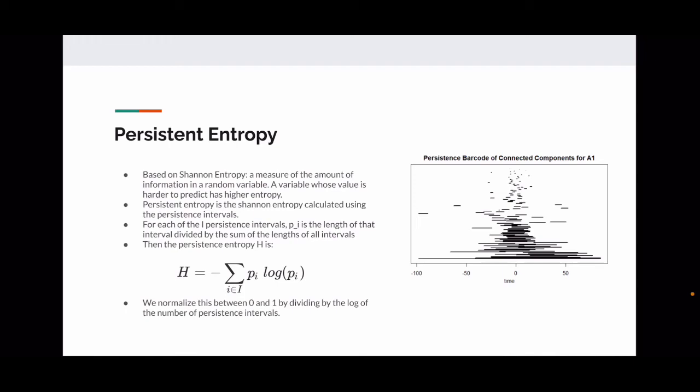Yep. Above 0.82 was normal, and under 0.82 was abnormal. Okay. And you just do that with that formula right there, and then you normalize it between 0 and 1, so that way you can see if it's 0.82 or closer to 0. Yeah. Okay, that makes sense.